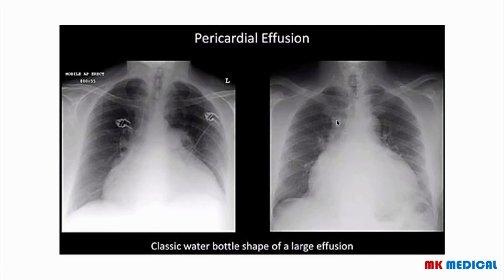We'll go in depth on these things in the subsequent lectures, because I will discuss each section. I will discuss the bones, the airways, the cardiac shadow, and the mediastinum separately. But this is more or less an overview of the systematic things that you're going to be looking at on x-ray, so that you're not lost during the course of the week.